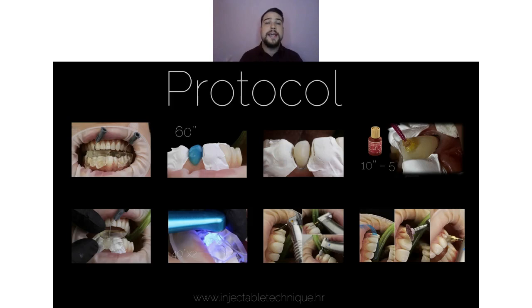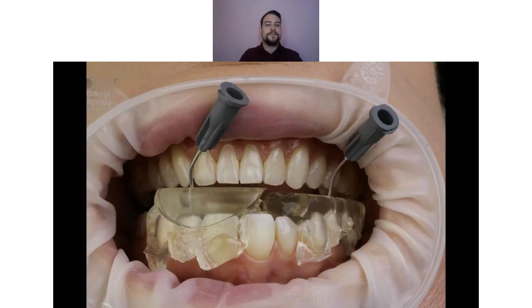The only difference is that the application of the composite is in a different way, following different ideas. Here, we are injecting flowable composite under pressure into the space of the mold, totally copying our wax-up directly in the mouth of the patient.